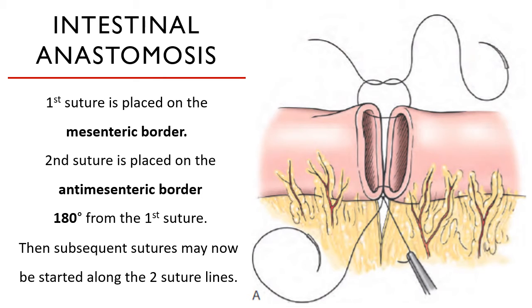All right. Now, the mesenteric suture is regarded as the most difficult suture to place because of the presence of mesenteric fat. This is also the most common site of wound dehiscence in an IRA. So you have to make sure that this is your first suture to make sure that the start of your anastomosis is correct. All right?